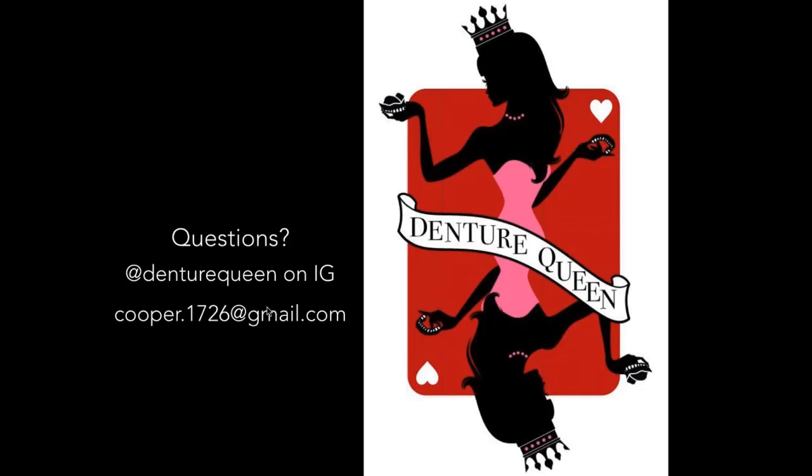The next question is, how much does it cost to get started? I don't think it costs anything for a doctor to get started. They would just need to contact their laboratory and find out what manufacturer system their laboratory is using or recommends. If you know of a specific manufacturer system that you would like to use, you can find out from that manufacturer perhaps what are the labs that they work with who have done a lot of cases. So all you have to do is contact your lab or contact the manufacturer and get started with what I would suggest is the custom tray wax rim technique or the reference denture technique.